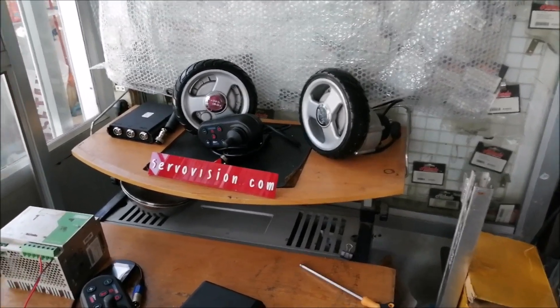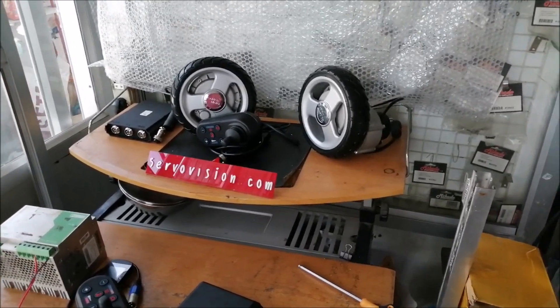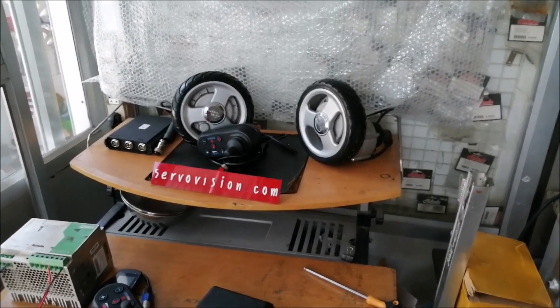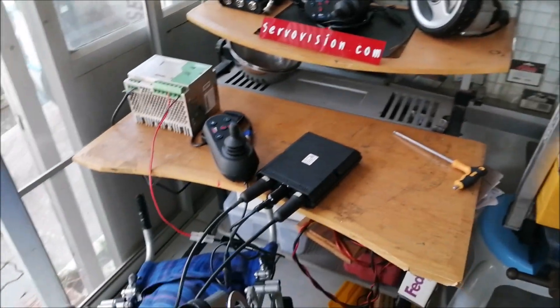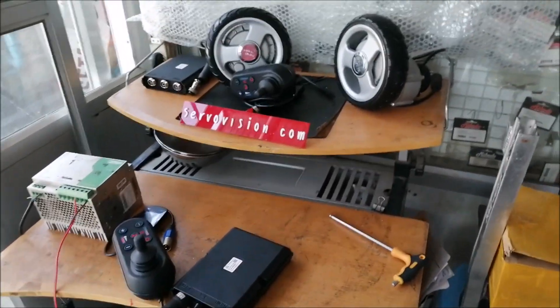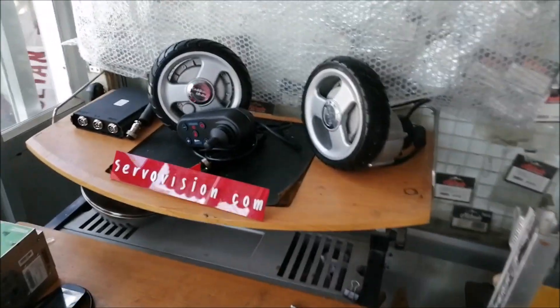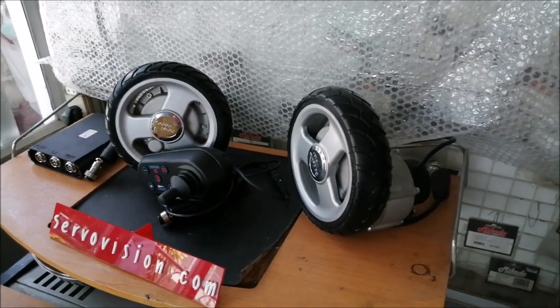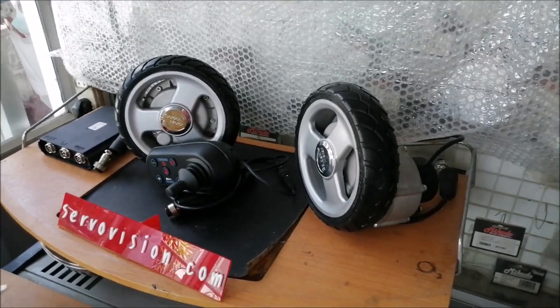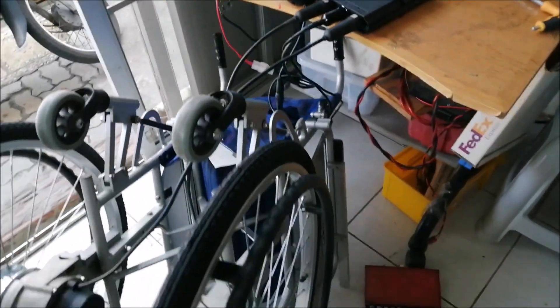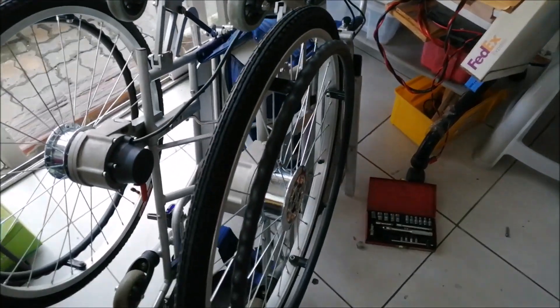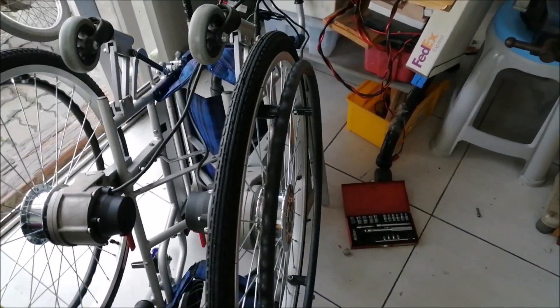Welcome back at ServoVision. In the last video I showed an example with a small wheel size, so this time I mounted the big wheel.